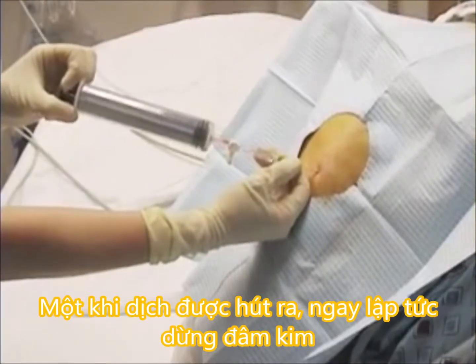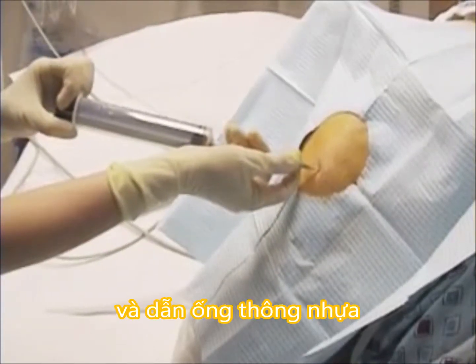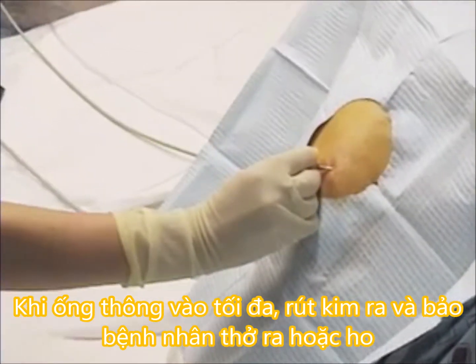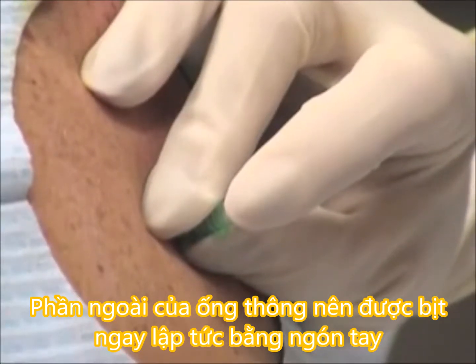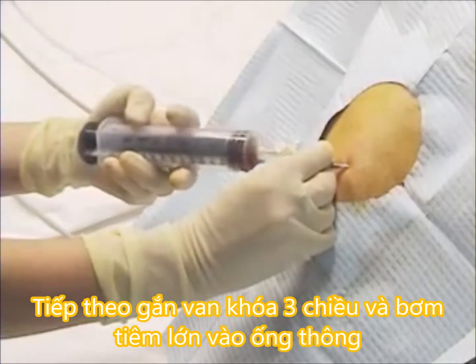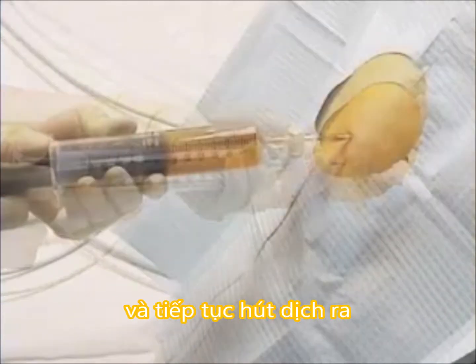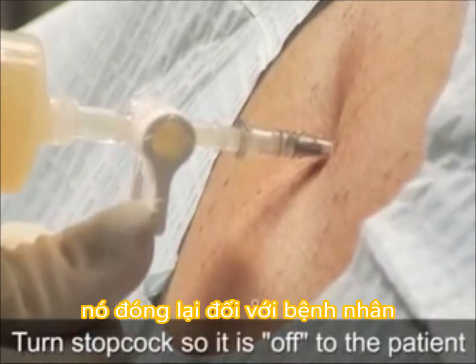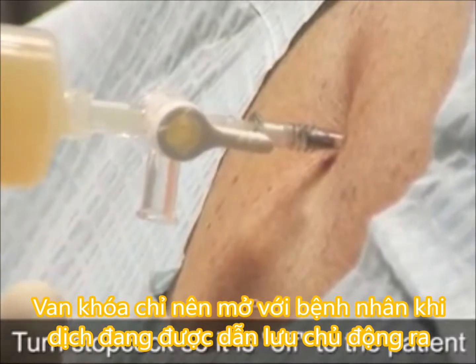Once fluid is aspirated, immediately stop advancing the needle and guide the plastic catheter over the needle. When the catheter is fully inserted, remove the needle as the patient exhales or hums. The exposed hub of the catheter should be covered immediately with your finger to prevent the entry of air into the pleural space. Next, attach the three-way stopcock and large syringe to the catheter and continue to aspirate fluid. When this syringe is full, adjust the stopcock so that it is closed to the patient. The stopcock should be open to the patient only when fluid is being actively drained.